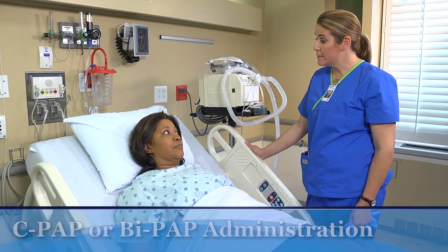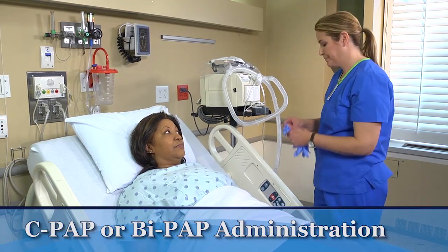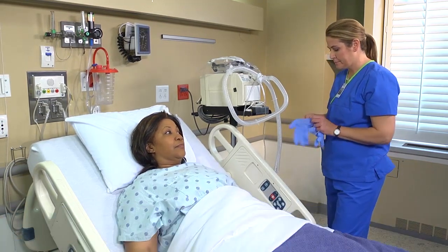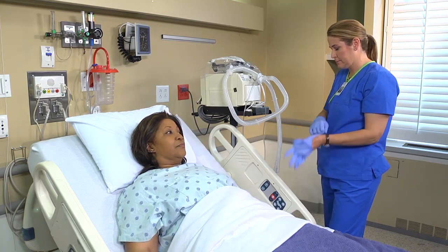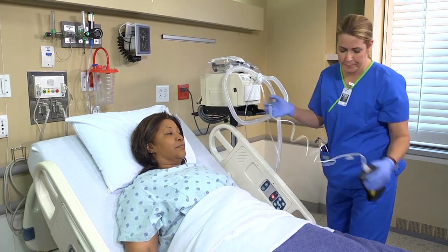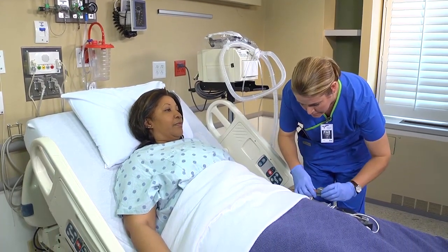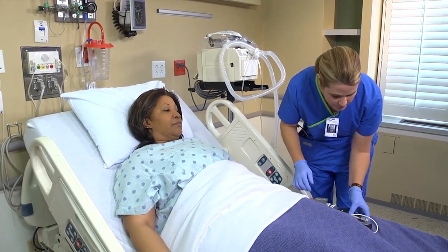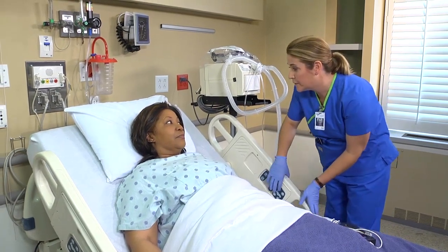Some patients will require continuous positive airway pressure or bi-level positive airway pressure to maintain an airway. These alternatives are known as CPAP and BiPAP for short. Begin by applying clean gloves and use a mask, gown, and goggles if the patient has projectile secretions. Apply the pulse oximeter and position the patient comfortably with her head elevated. The bed so it's easier to breathe.